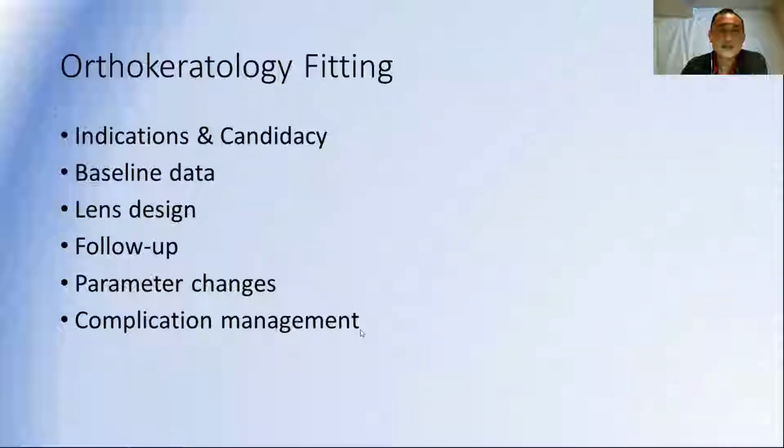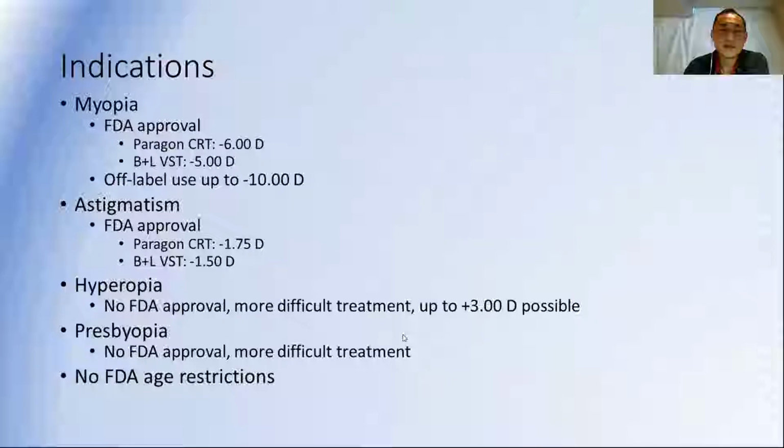All right, so let's get into the actual fitting of Ortho-K lenses. There are a number of things that we have to do to, first of all, determine if they are a good candidate, and then how do we design the lenses, and then follow up patients and make changes when the patients aren't responding appropriately. So again, the indications, we already talked about this.